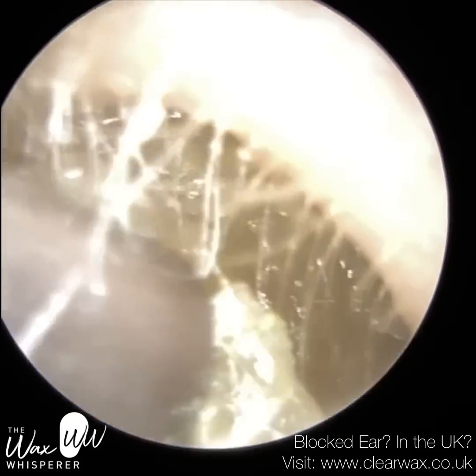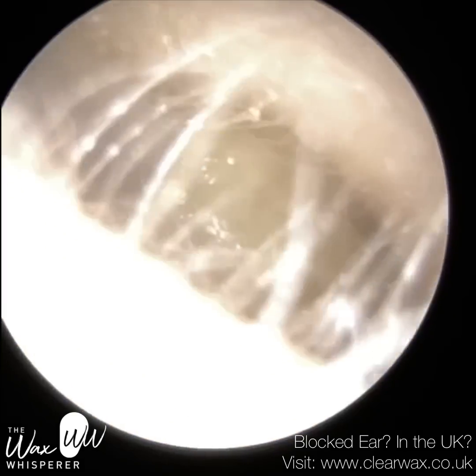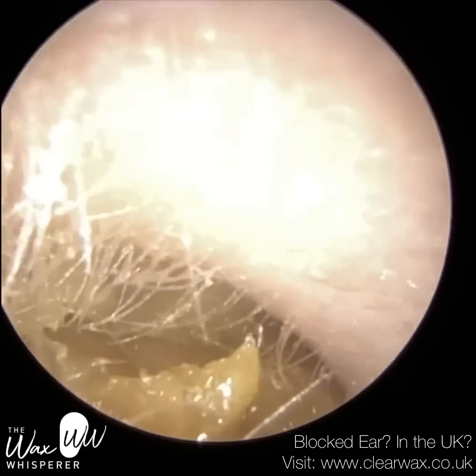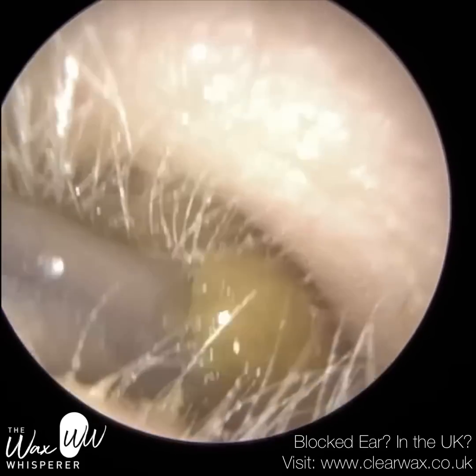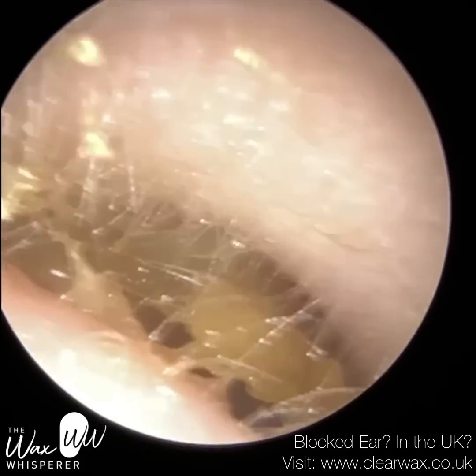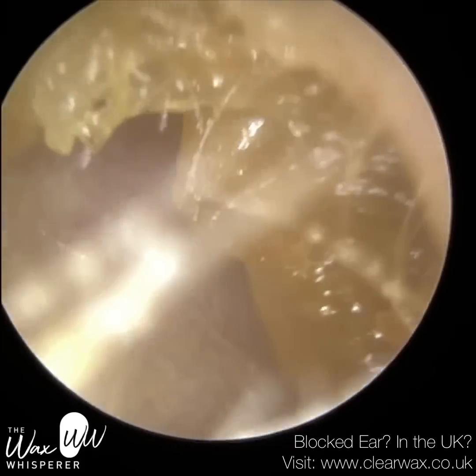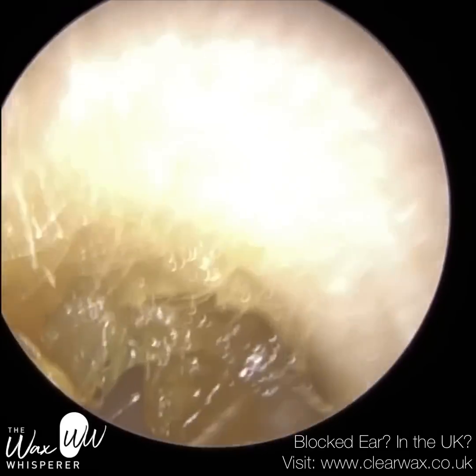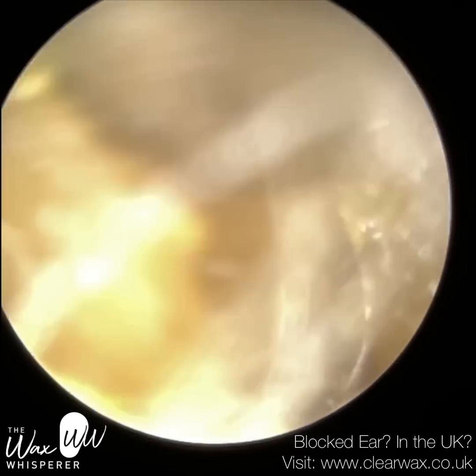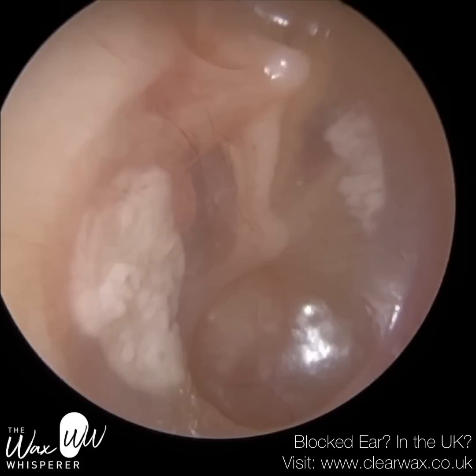And this is the right ear — again, similar consistency, quite soft and mushy. Sodium bicarbonate is water-based, so not only does it break down earwax through the formation of carbon dioxide and the conversion of a liquid to a gas, effervescence and mechanical foaming break up the dead skin contained within earwax — 60% of earwax is typically dead skin — but it also breaks up the skin lining the ear canal. The skin cells absorb the water, then overhydrate and burst from their membranes, which again makes the skin very mushy.